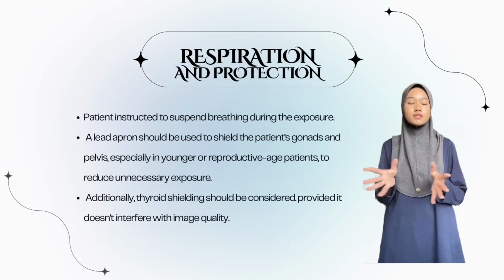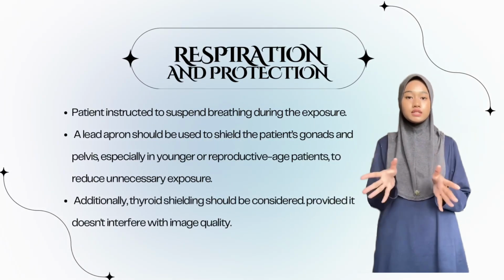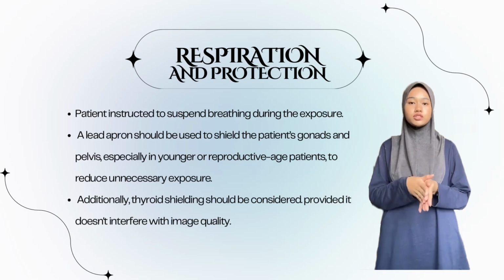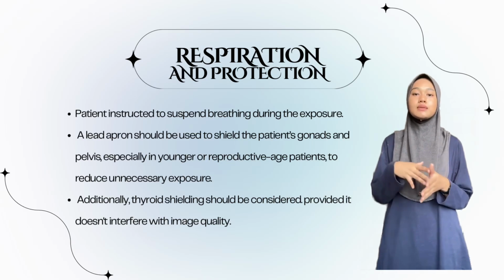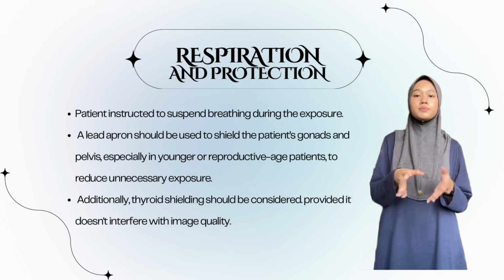Next, I will explain the breathing instruction in posterior oblique shoulder projection. The patient is typically instructed to suspend breathing during the exposure. This means the patient should hold their breath after inhaling or exhaling to minimize motion and ensure a clear, high-quality image.